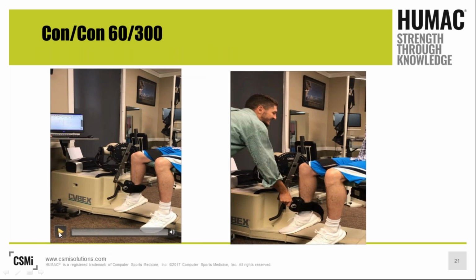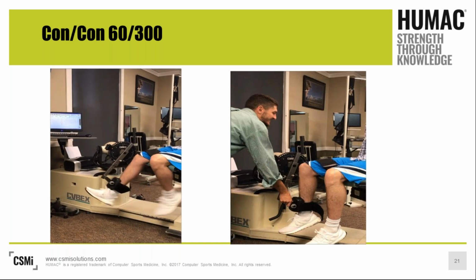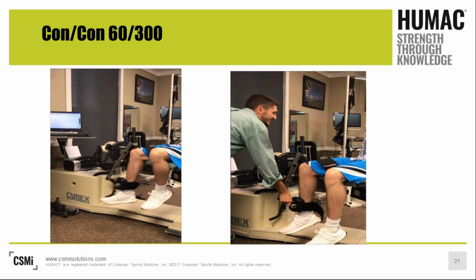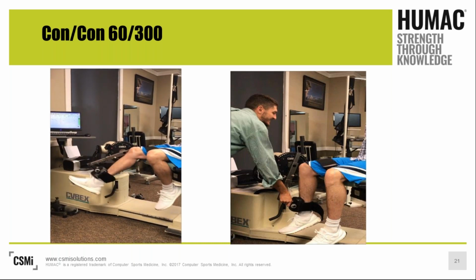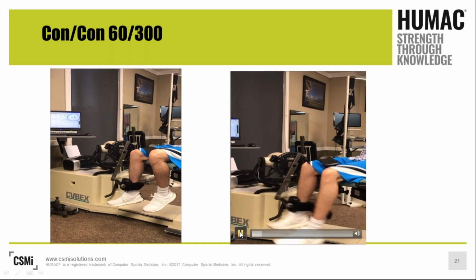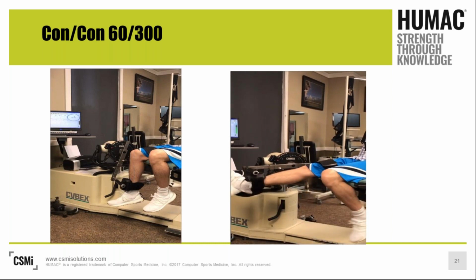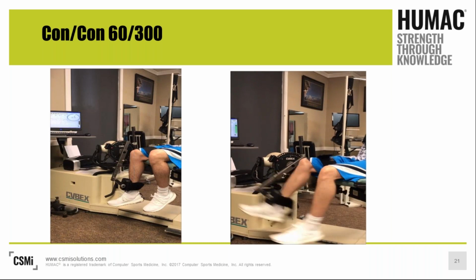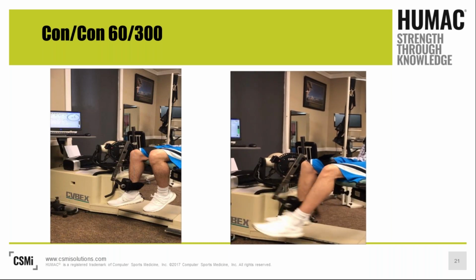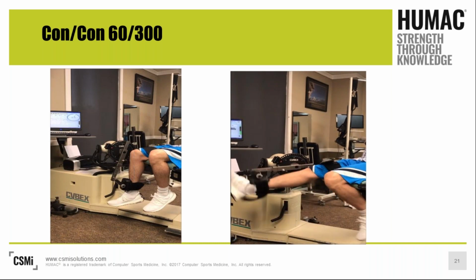So I'm going to tell you right now, I'm not a big fan of concentric reciprocal contractions. If you're going to tell me, this is what I should be doing, I'm going to tell you you're right. It's not real functional. It could be a little more difficult. And especially if we're going at fast speeds, we might have some shear stress to the patella. We might have some difficulties associated with that. And I want to make sure that we're adapting this to every single patient that we're seeing appropriately.